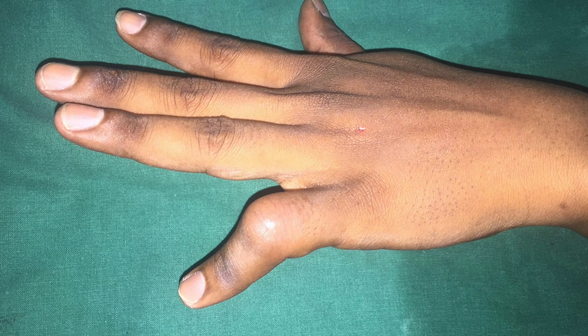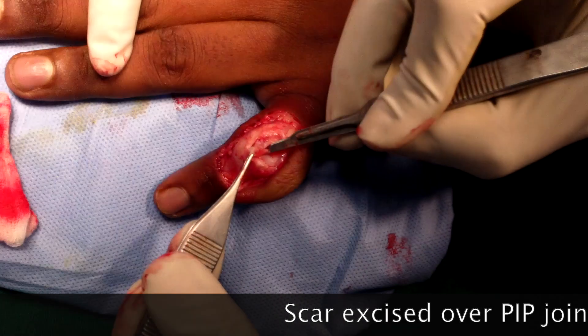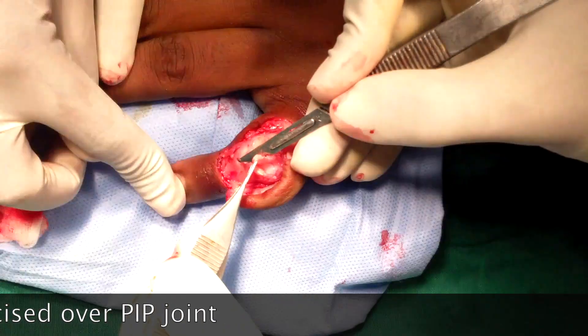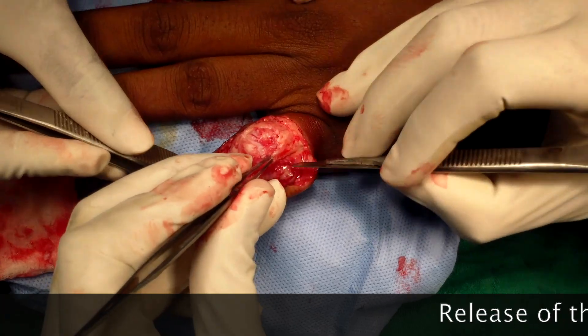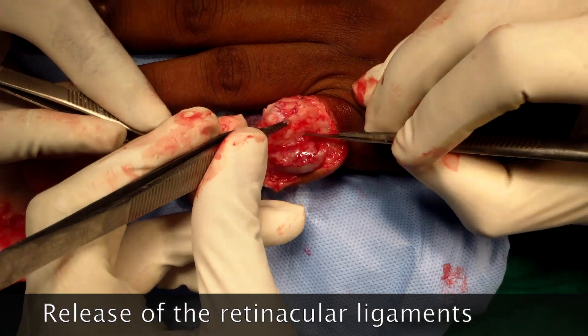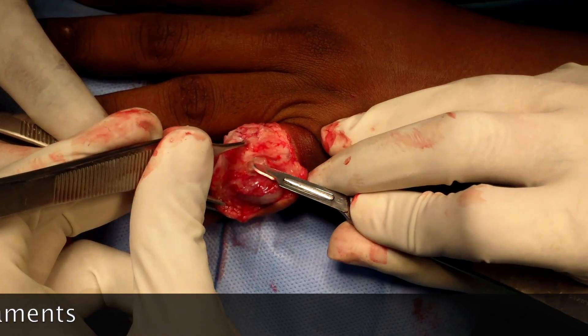We shall now see the surgical procedure of boutonniere correction for a two-month-old injury of the central slip, demonstrating all the steps described. The dorsal aspect of the PIP joint of the little finger is opened by a cross-finger flap-like incision based on the ulnar side. The scar over the PIP joint is first excised. The transverse retinacular ligament is then released on the ulnar side, and as this step is done, the lateral bands are seen to gradually release.